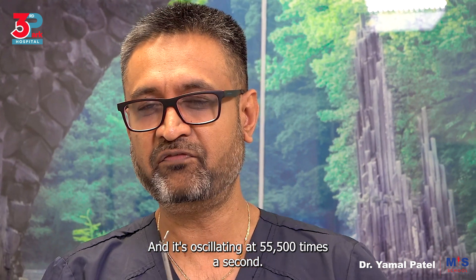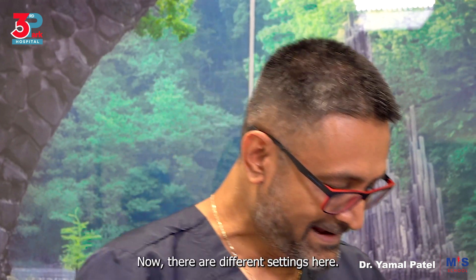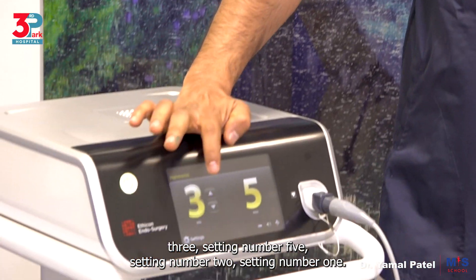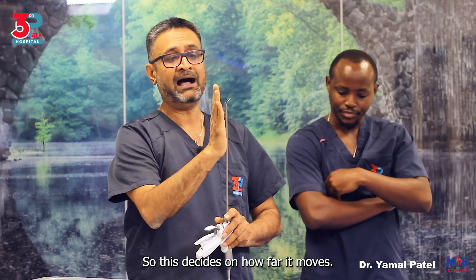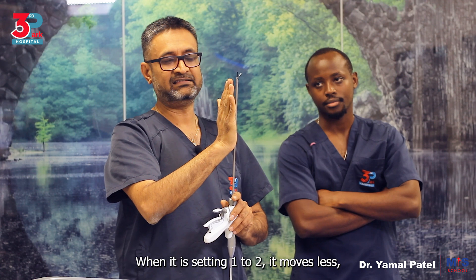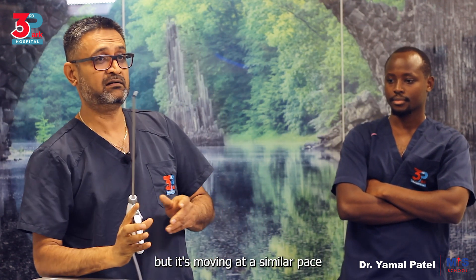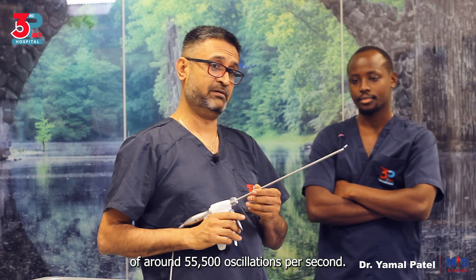It's oscillating at 55,500 times a second. Now there are different settings — setting number one, two, three, and five. This decides how far it moves, between 30 and 60 microns. When it is setting five it moves 60 microns; when it is setting one to two it moves less. But it's moving at a similar pace of around 55,500 oscillations per second. So it is vibration or friction energy, not electrical energy.